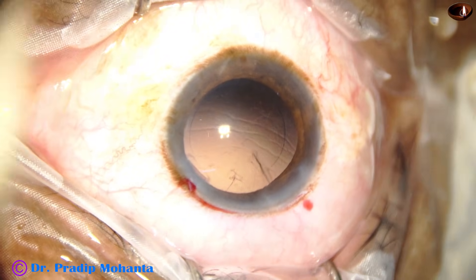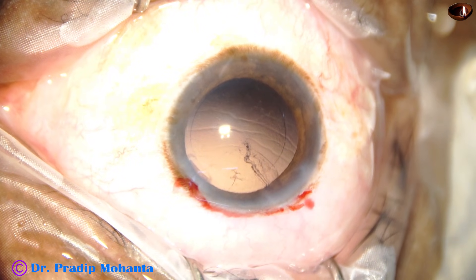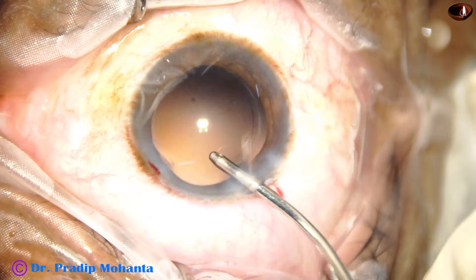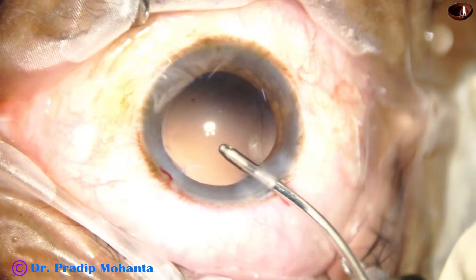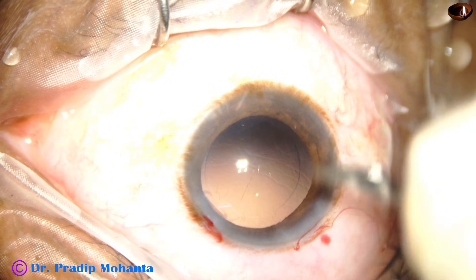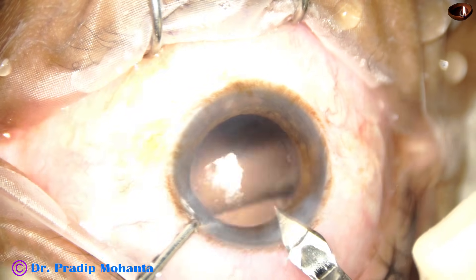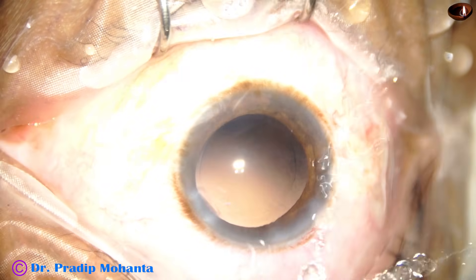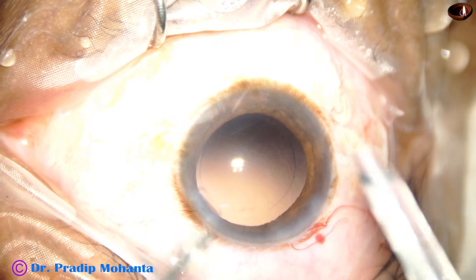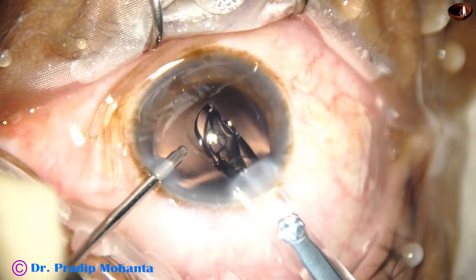Now we have to implant an intraocular lens. Something has gone inside the anterior chamber from outside — this happens when the intraocular pressure is less than the atmospheric pressure. The main wound is being enlarged a little because I am going to use a B-cartridge. An acrylic monofocal intraocular lens goes into the capsular bag.